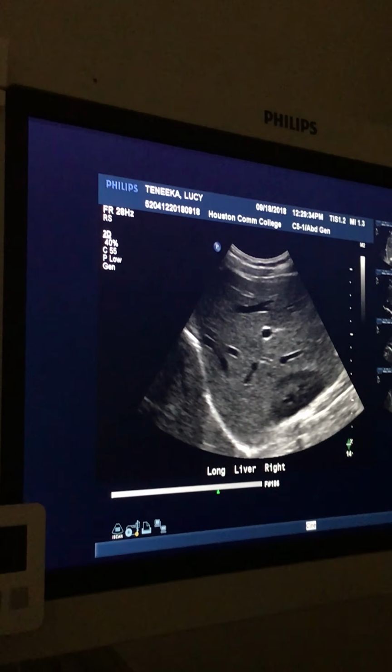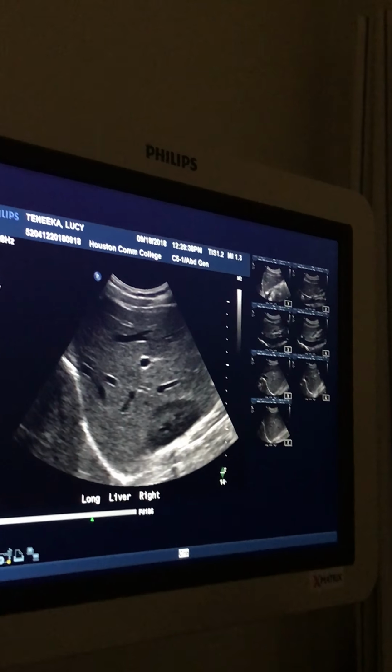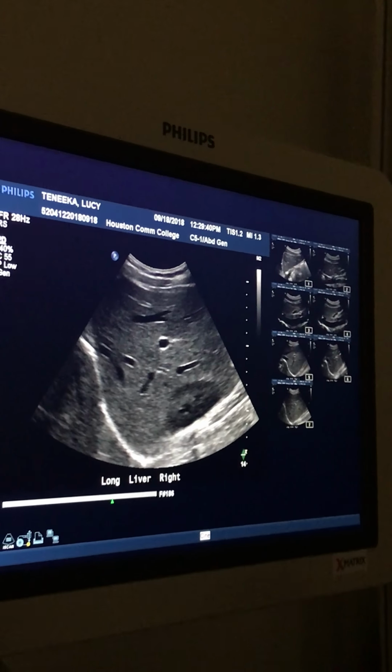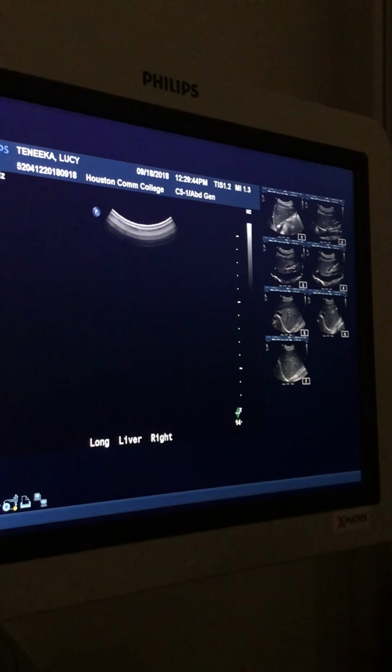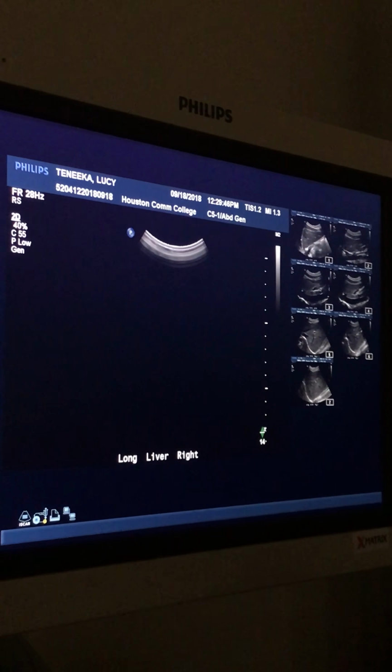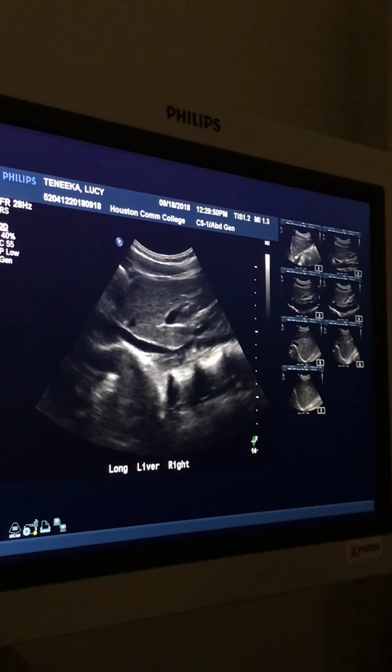You will have to adjust your picture, but as I'm moving, I do my adjustments, whereas you'll move and then adjust and then adjust, you know what I mean? So it is more than just that, but for the most part, everything's very close together, so it's not that much. All right, deep breath and hold it.